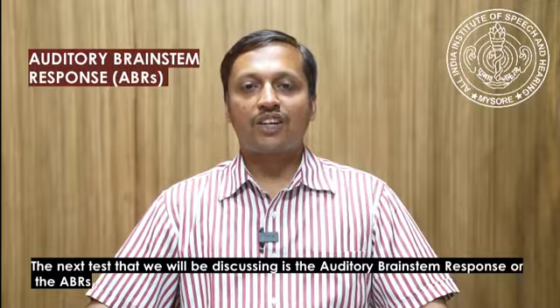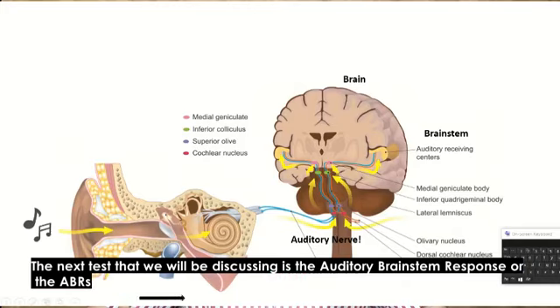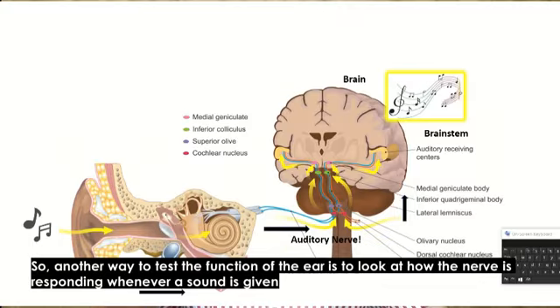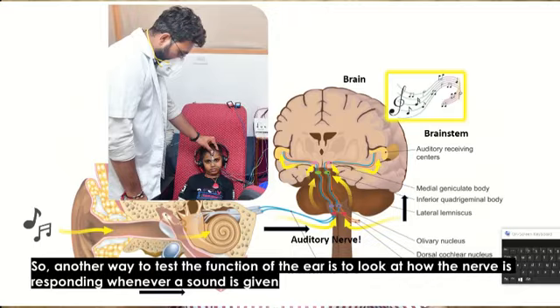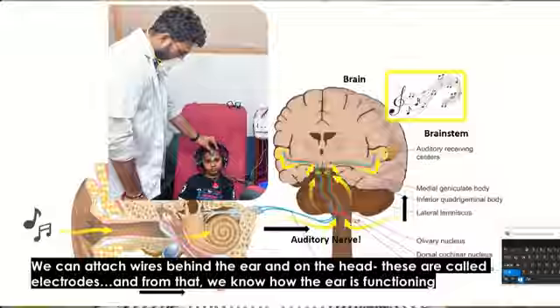The next test that we will be discussing is the Auditory Brainstem Response or the ABRs. When a sound is given, it goes from the outer ear to the middle ear to the inner ear, and after that it goes to the nerve and higher structures and finally to the brain. That is where we hear sound. Another way to test the function of the ear is to look at how the nerve is responding whenever a sound is given. We can attach wires behind the ear on the head, these are called electrodes, and from that we know how the ear is functioning.